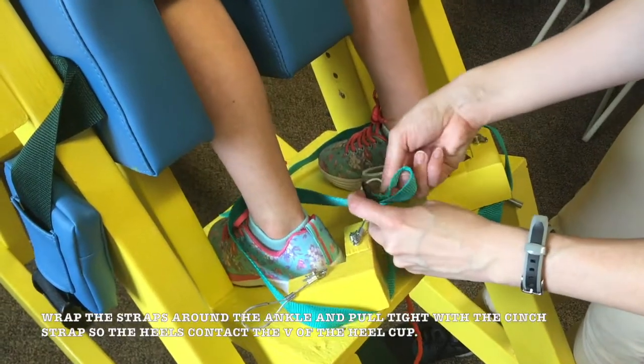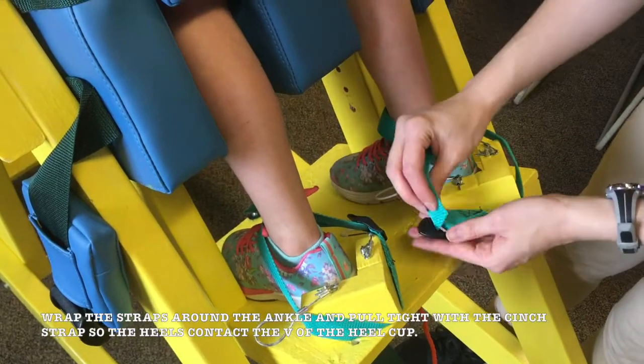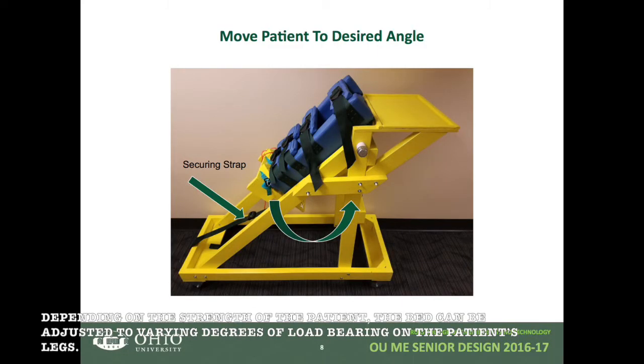Next, wrap the straps around the ankle and pull tight with the cinch strap so that the heels of the patient contact the V of the heel cup. Depending on the strength and involvedness of the patient, the bed can be adjusted to varying degrees of load bearing on the patient's legs.